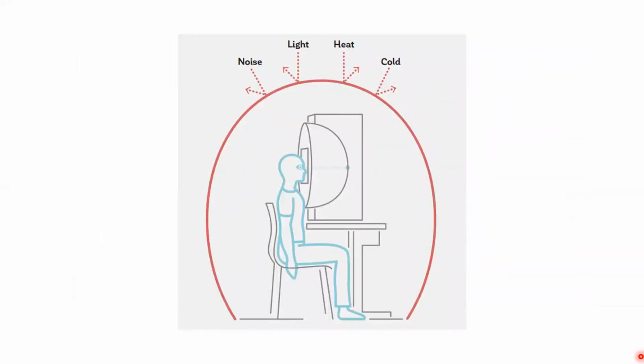Well, as you can see, there are modern or very sophisticated methods for examining your patients with glaucoma. But I would like you to remember that perimetry is still a subjective method. The result always depends on the motivation and cooperation of your patients and the conditions for the test. So please keep this in mind.